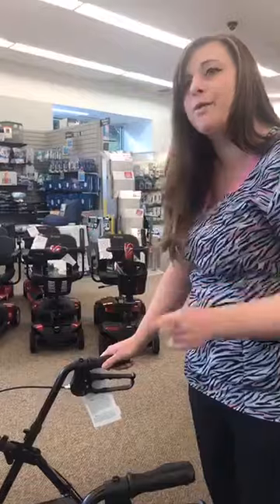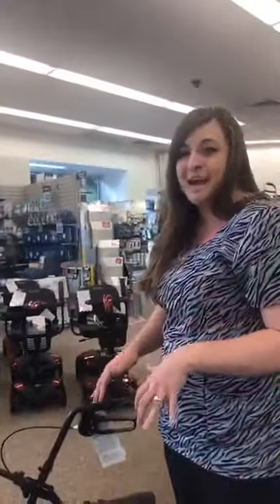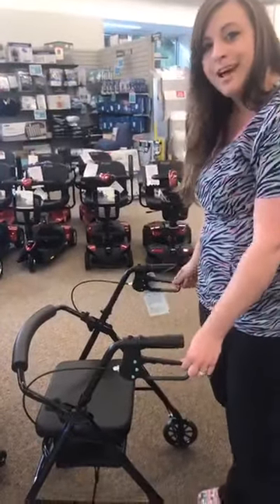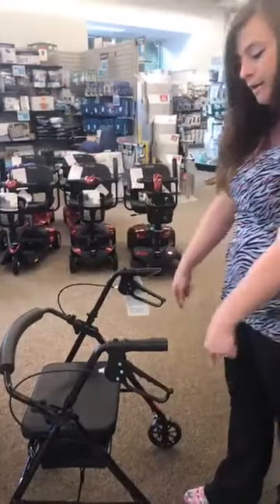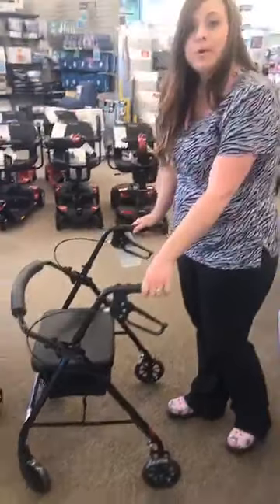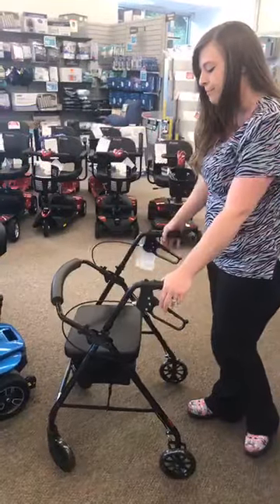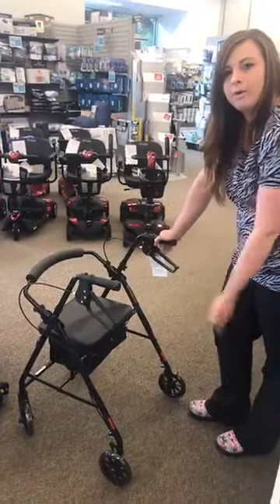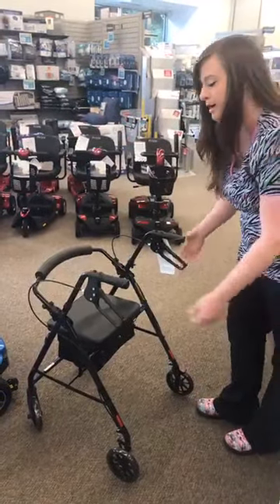But now here's the most important part that we really want to stress to people. Before you sit down in this rollator or before you stand up and get back out of it, these brakes actually have a locking mechanism to them. If you push the brakes down, it'll lock those back wheels into place. So when you have them locked, it's less likely to roll out from underneath you before you stand up or before you sit down. That's the number one thing that we see with people when they roll out from under them. So you just have to be very, very careful and remember to use those brakes.